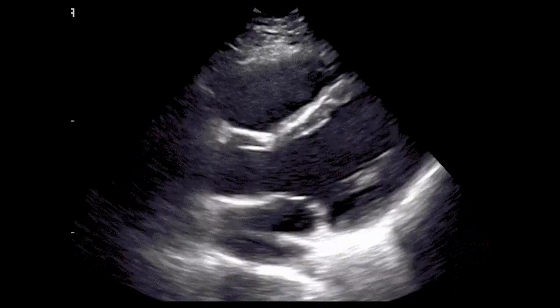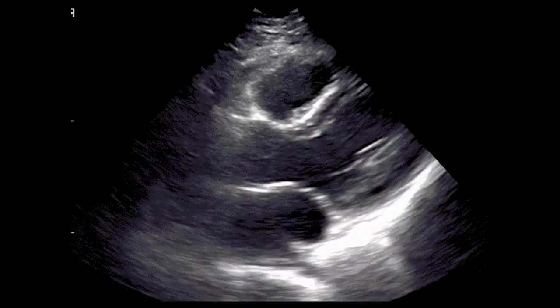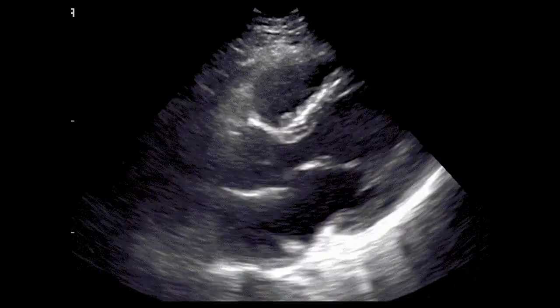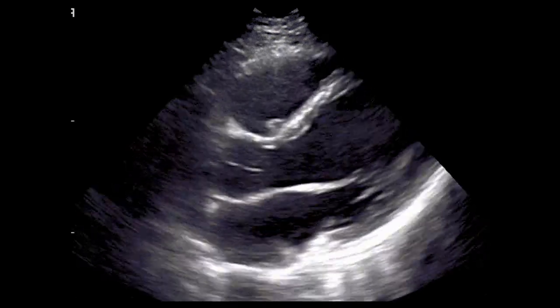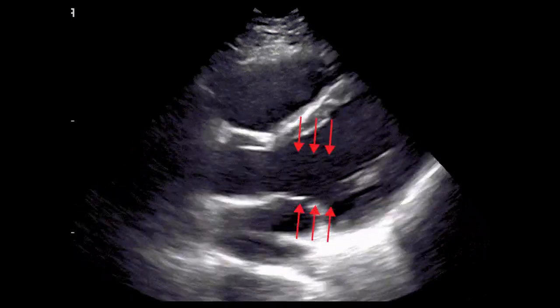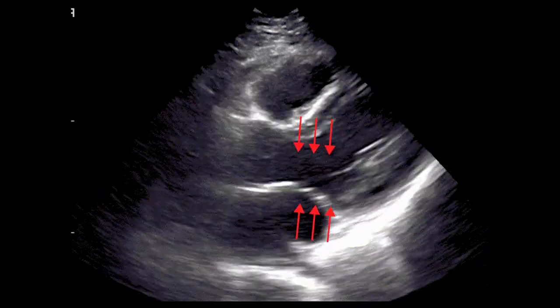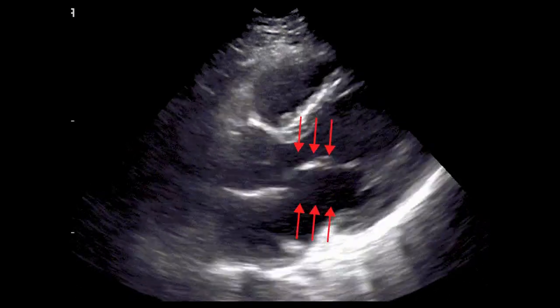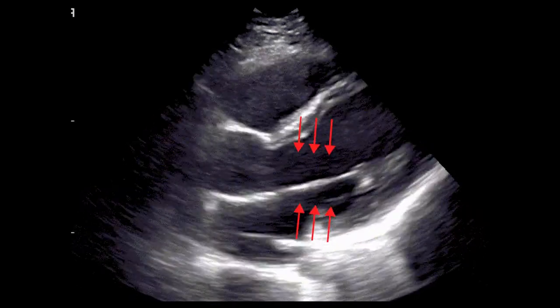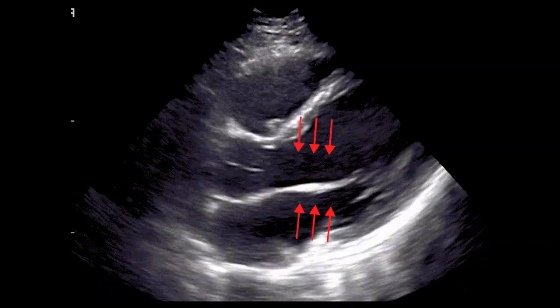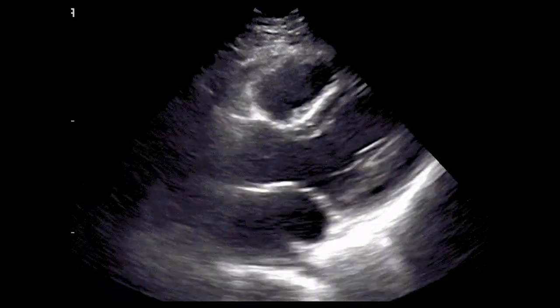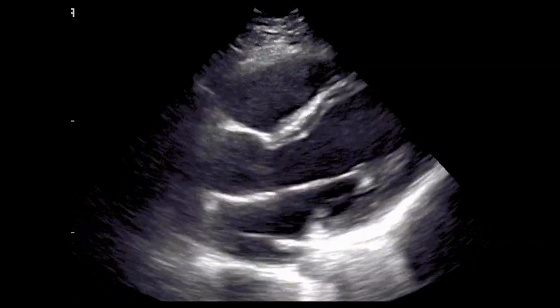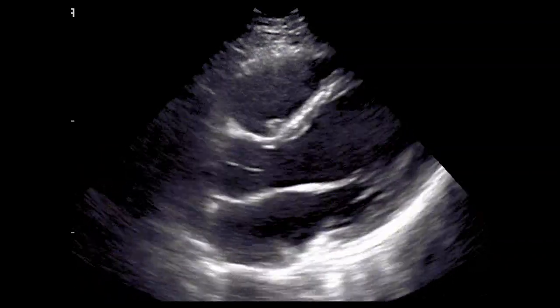Another structure that can add data to your gestalt is the movement of the anterior mitral valve leaflet, seen here, which will typically open more vigorously in a heart that has better systolic and diastolic function. Quantifying this movement will be the subject of a future video.